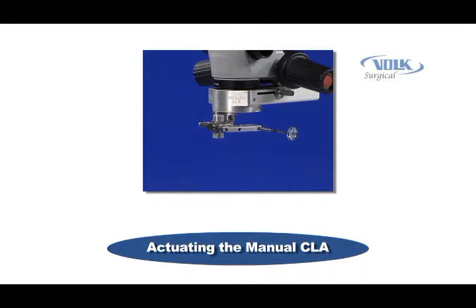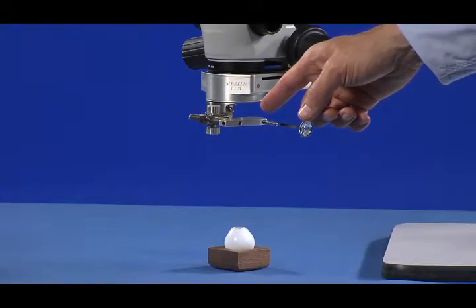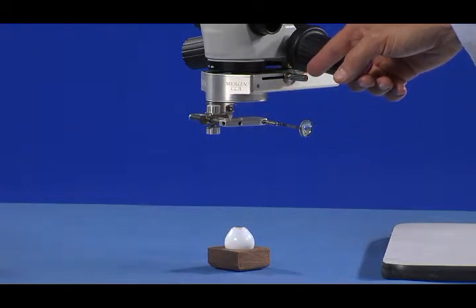Actuation of the manual CLA is extremely easy. Simply switch the LPU as needed between its up and down positions, and then move the CLA condensing lens to its appropriate location using the sterile handle.